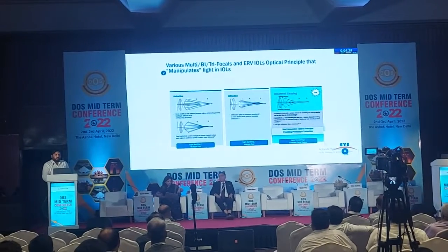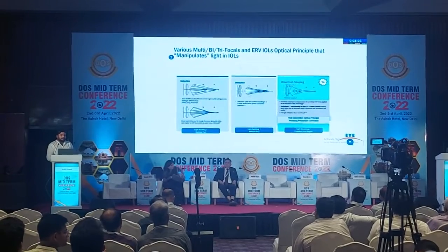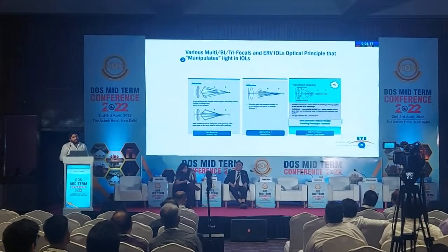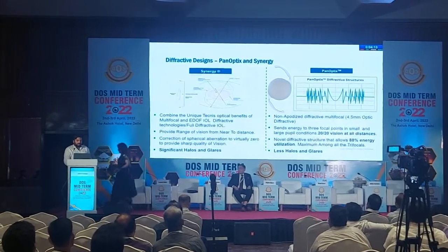So it's a very unique kind of principle in which they have worked on the central 2.2 mm, and it creates a delay in the overall wavefront, giving that elongation or extended depth of focus. So that's a new technology.